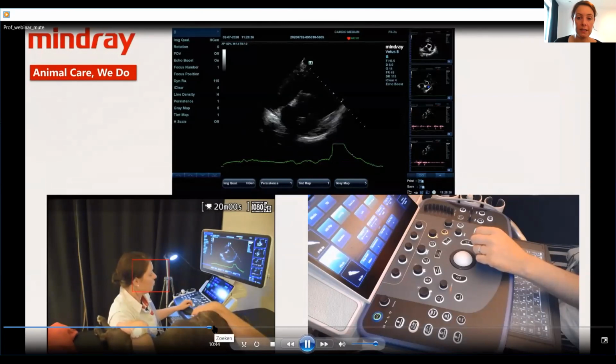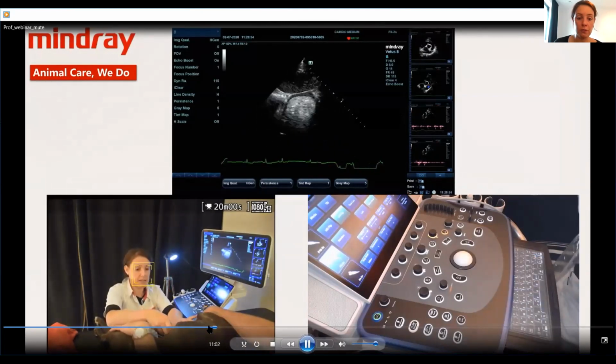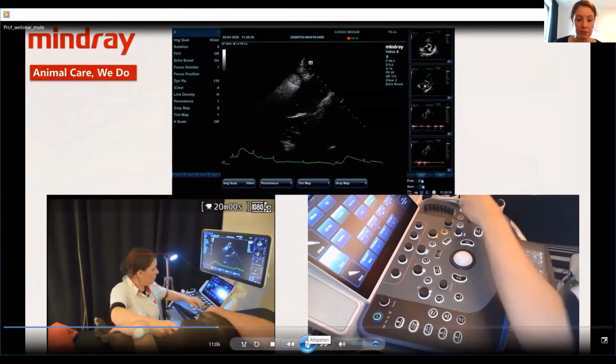Good. Then we will move on to the subcostal image or the subxiphoid image. I'll just freeze here for a second. So our dog is still lying on the right side, the head is here. This is the chest, and here we are actually below the xiphoid, so in the liver region. You shave, or you put some alcohol on this region, right below the xiphoid. And then with your ultrasound probe, you put some gentle pressure first downwards, and then you angle your probe towards the head of the dog.